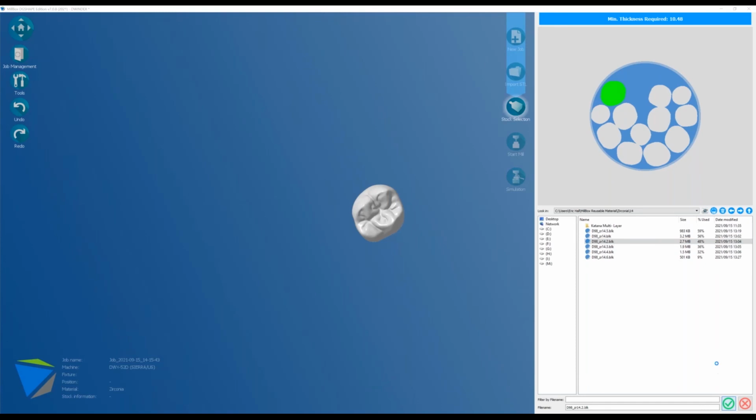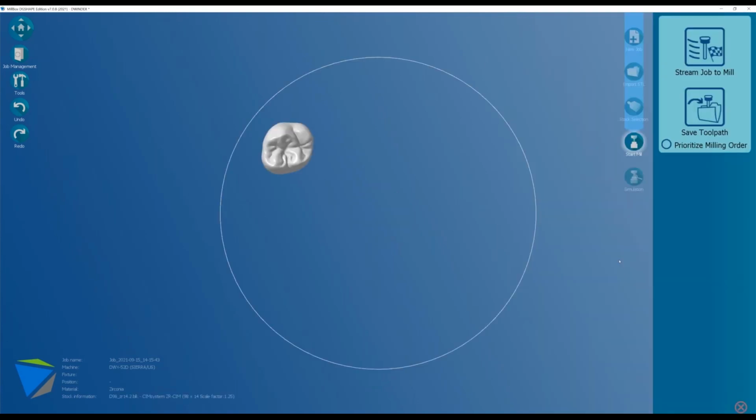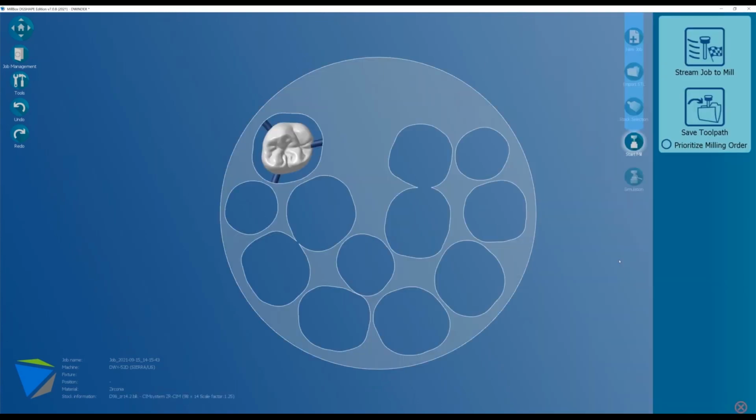So what a cool feature. It's helping you save material costs. Man, that's it as a lab, right? You're paying a lot of money in materials. And the more you can keep from waste on the material side, the better you guys are going to do as a lab. So I wanted to show you that feature. Let me go back to PowerPoint and I'll show you and just talk about one other very cool feature right quick.